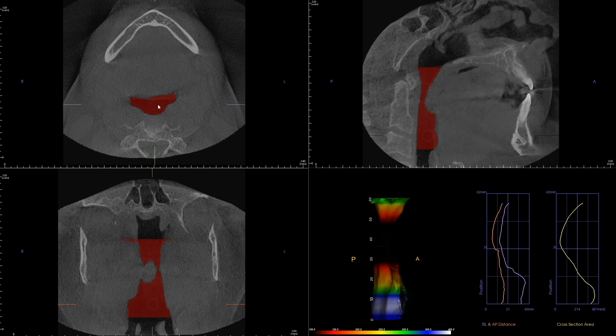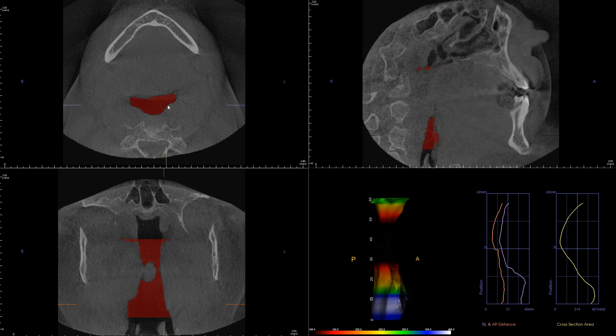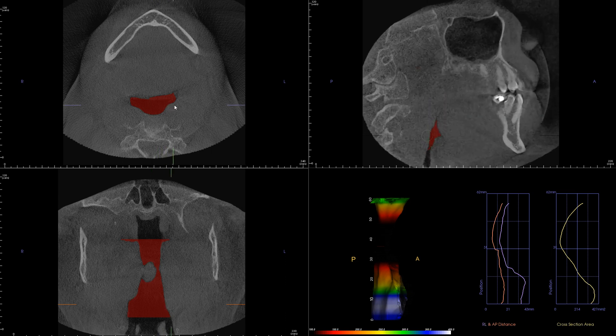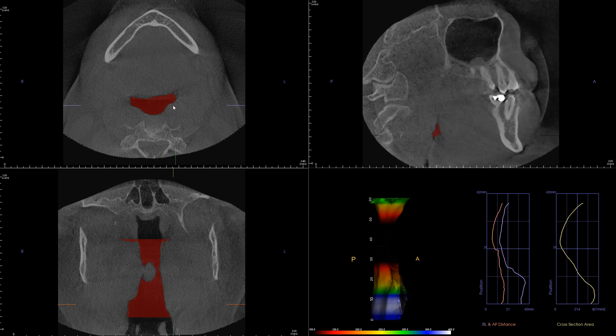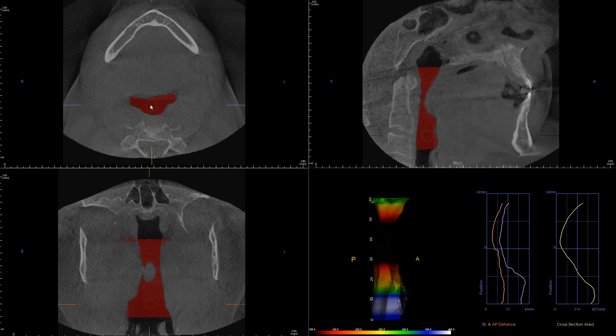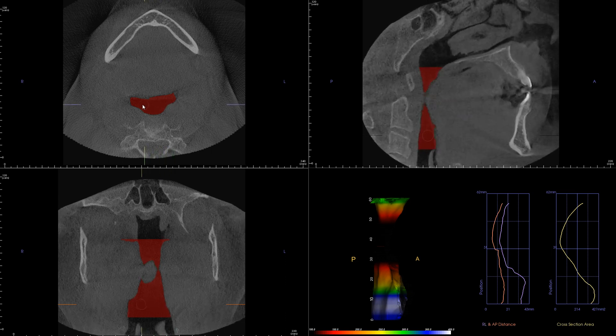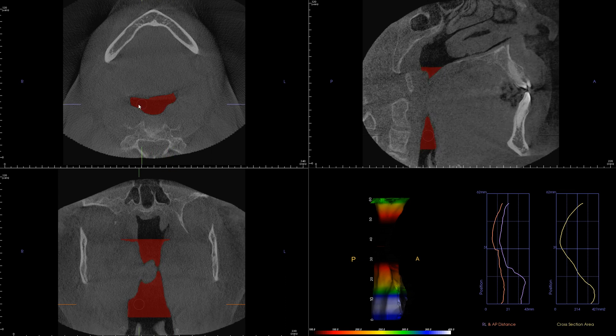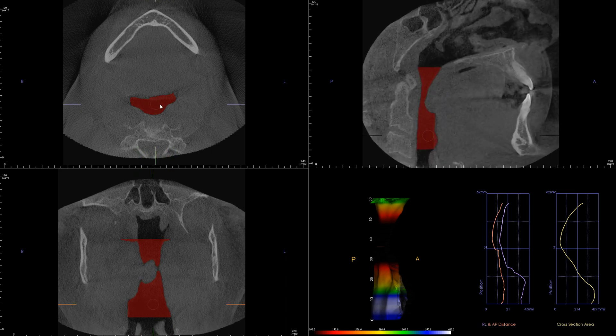Let's observe that one more time as I move through the volume from the patient's right to left and back to the right.